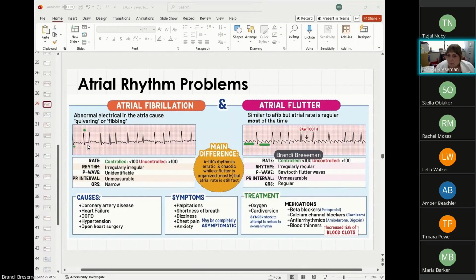So right here, I'm like 1, 2, 3. And then here, that's my T wave. So I'm going to go 1, 2, 3. And then I have 1 in here. The other one might be buried underneath.